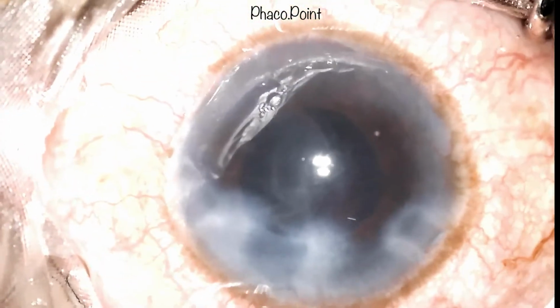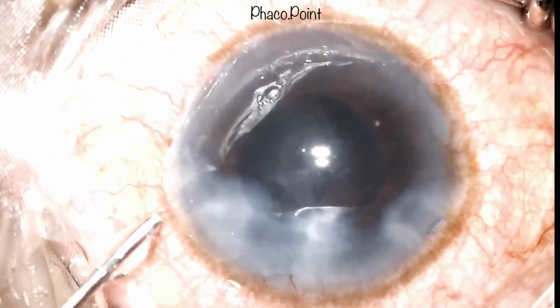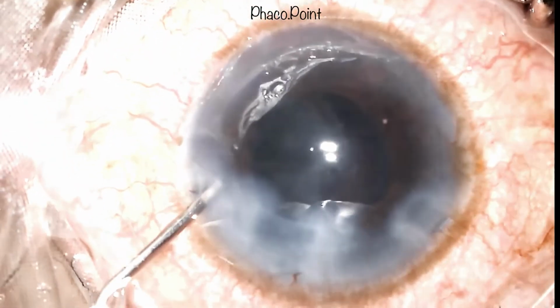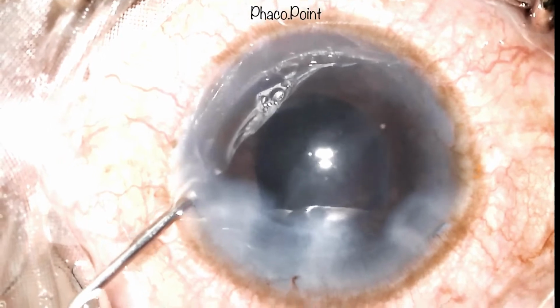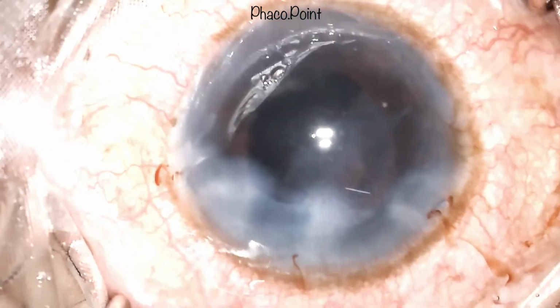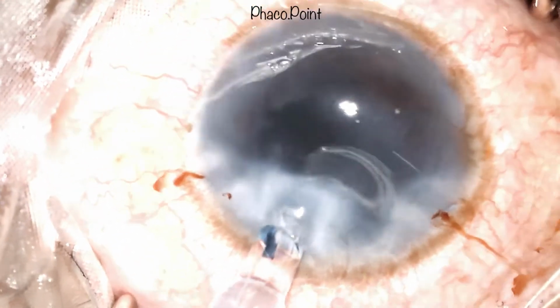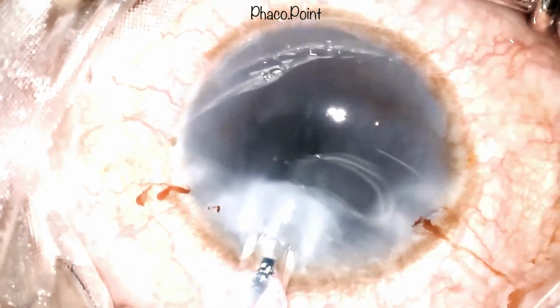As you will now see, we are left with a subtotally detached Descemet's membrane, which is now shriveled up upon itself, floating in the anterior chamber. I now introduce a little viscoelastic, move the Descemet's slightly on the side, and then implant a single-piece monofocal IOL carefully in the capsular bag.